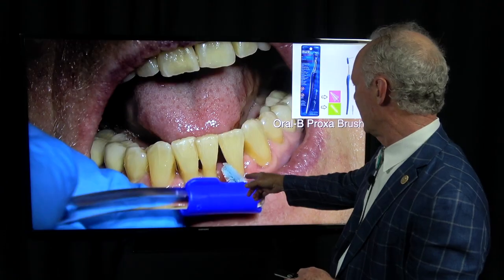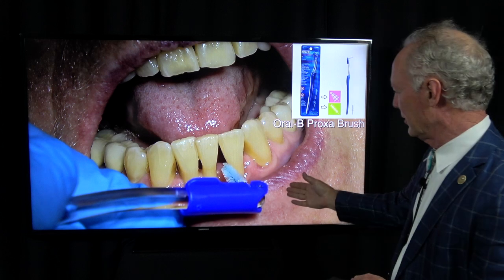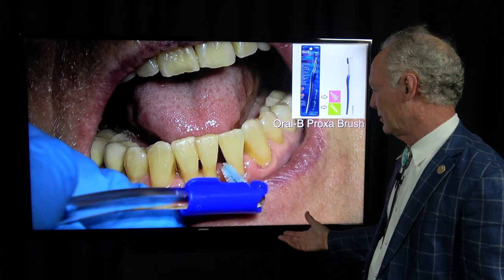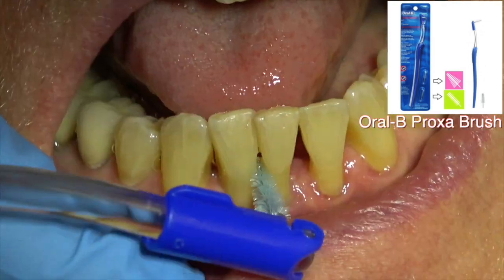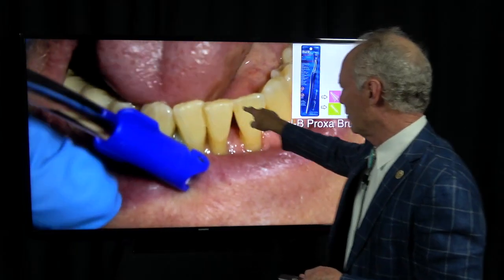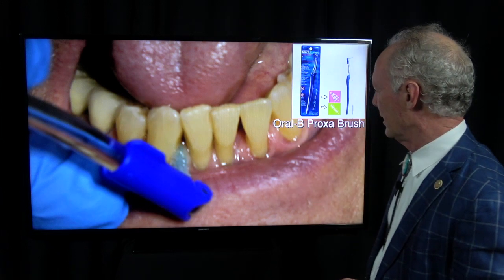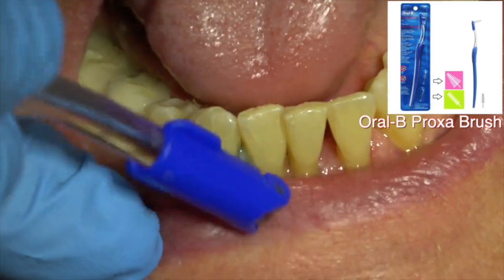Then come back with Shofu rubber wheels and polish it nice and smooth. Then show the patient how to use these — I like the Oral-B Proxa brushes where you can change the heads. Stick it in there, bend it, and they can get between the teeth. Use a proxy brush with chlorhexidine or mouthwash to keep them clean. This is not as good as flossing, but it's effective in these cases. I want to put the wire up on the tooth incisally, not way down at the gum line, because you want space to get the proxy brush in.